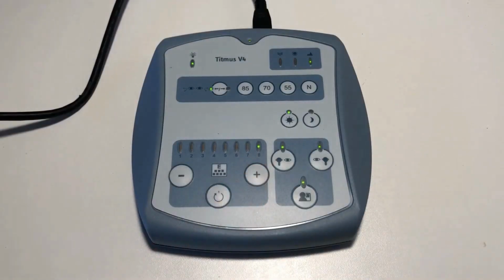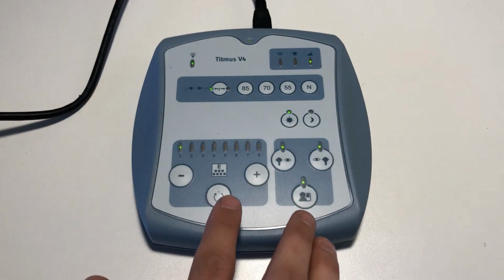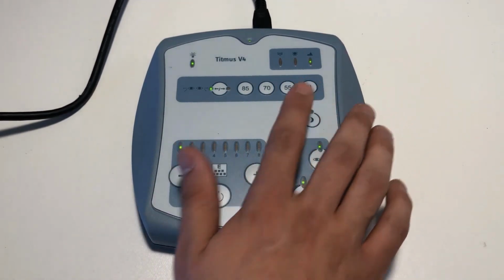Advance the slide back to number 1. Here we will be testing for peripheral vision. Ask the patient to raise their hand each time they see a light flash. We will test for temporal vision at 85, 70, and 55 degrees, followed by a 45-degree nasal test.